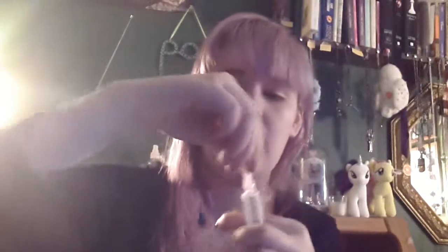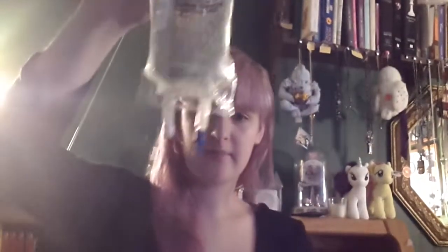Put the cap back on your needle, then you can twist it off and put it in your sharps container. And that is how you prep your IV bag with a needle.